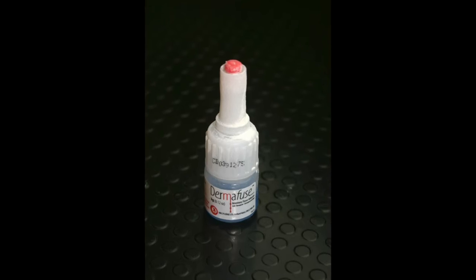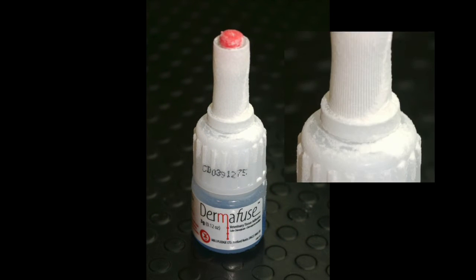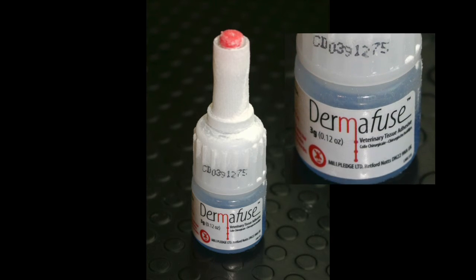It is worth noting that a white chalky substance may form on the outside of the bottle. This is known as bottle blooming. This is normal and does not compromise the effectiveness or the integrity of the Dermafuse.